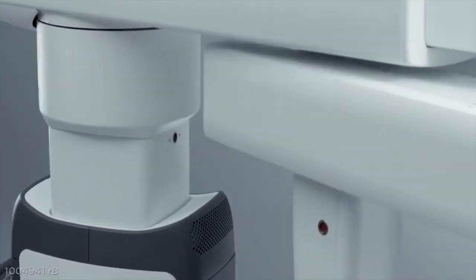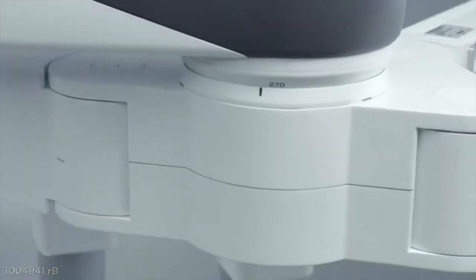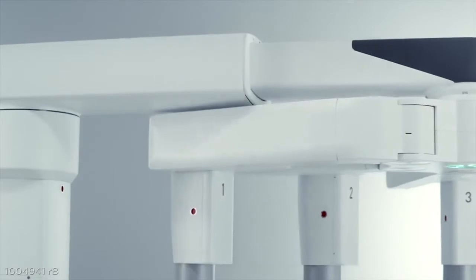The overhead boom allows the arms to rotate as a group and this frees up valuable space inside the surgical field, allowing unobstructed access to the patient.